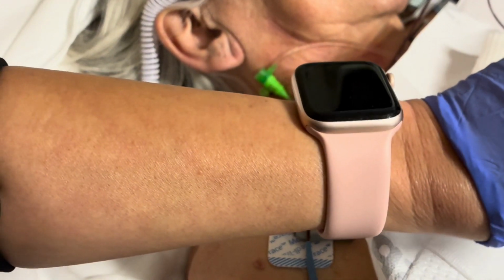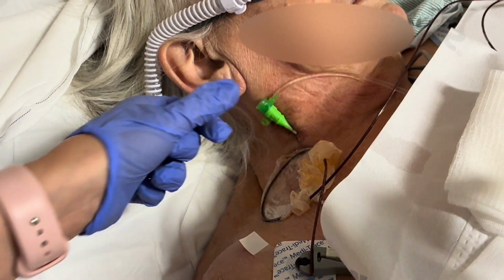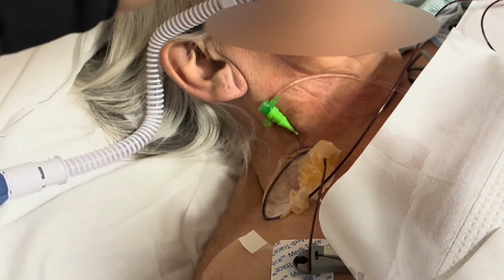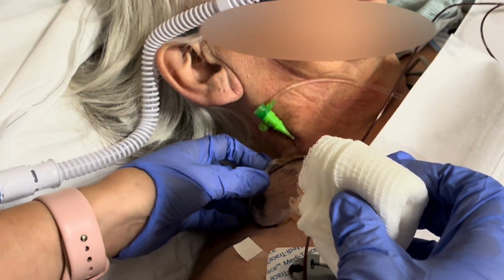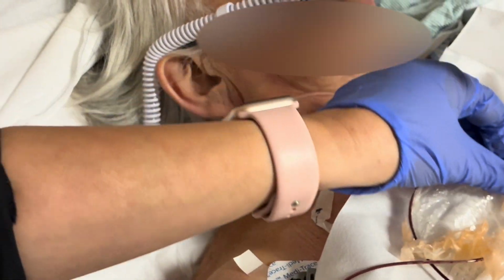So we took out one suture. Now we have the cordis, so we're gonna take this out. And oh, you want me to just do it? So this is already out, right, Jamie?